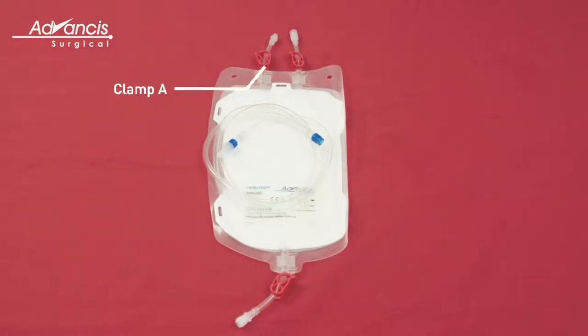Clamp A is for priming the bag. Clamp B is for connecting the intraoperative kit or cardiopulmonary bypass machine to fill the bag with blood for processing. Clamp C is for draining into the blood transfusion bag after processing.